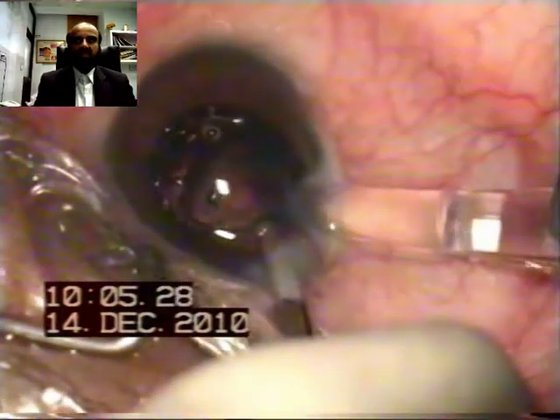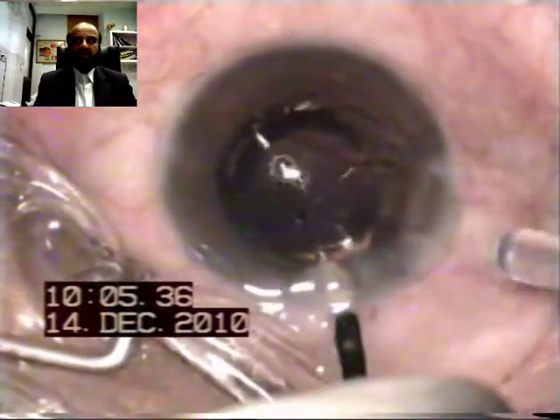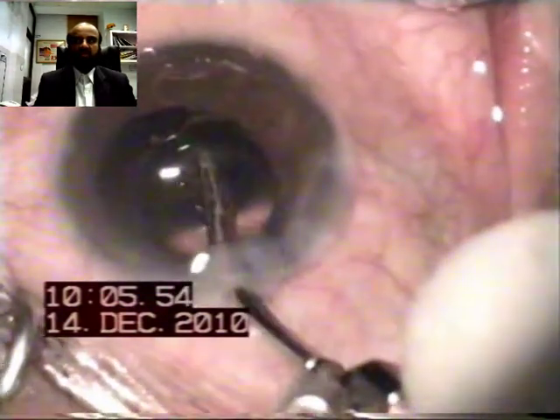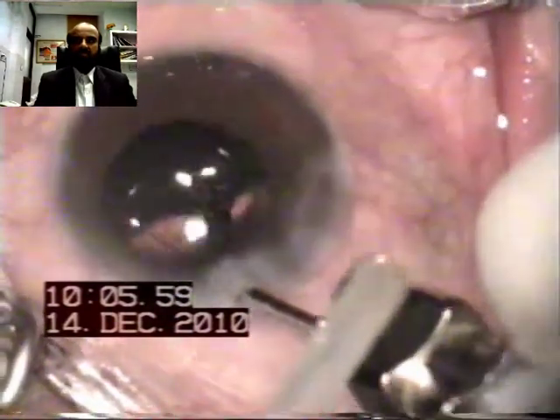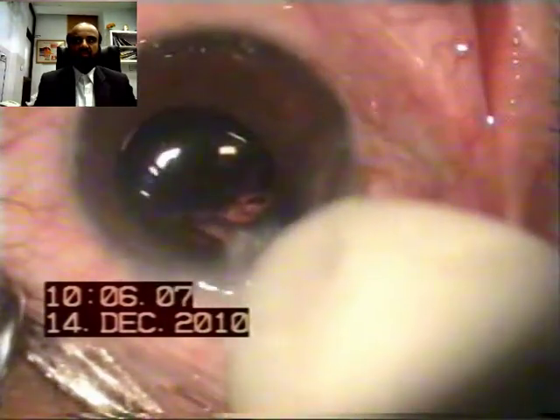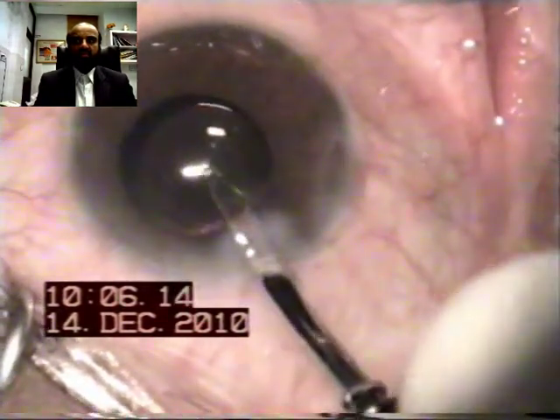The final positioning is performed with the help of a Simco cannula. The IOL haptics are placed one by one inside the bag. It is a very simple procedure — no viscoelastic has been used, so there is no need to aspirate. The IOL is simply positioned and the remaining cortical matter is removed with formation of the anterior chamber.